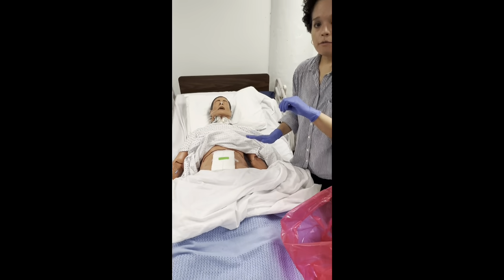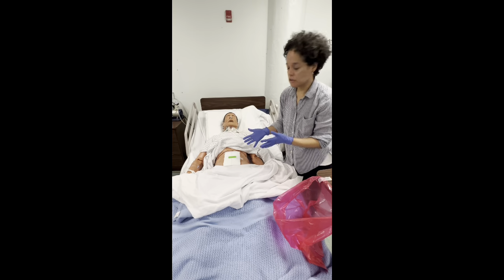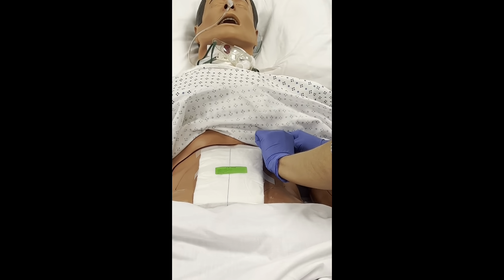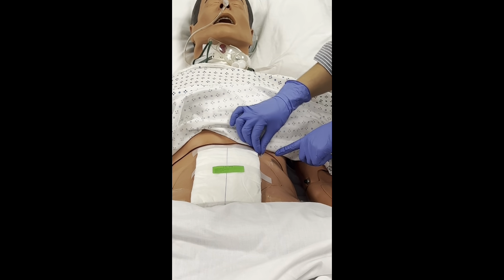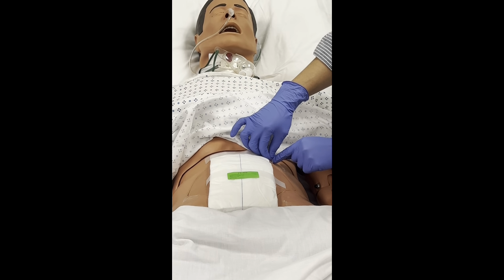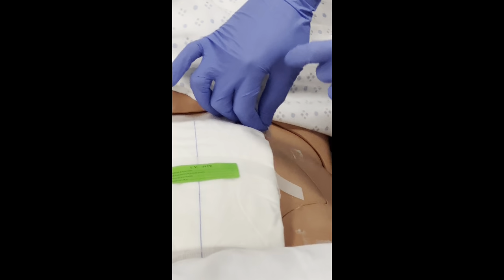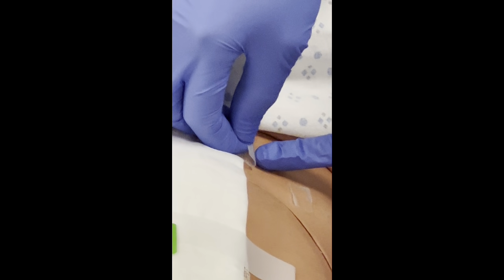You want to be mindful of your patient's skin integrity as you're doing so, please be very gentle. Okay, so let's demonstrate how this is done. Okay, so I have a piece of tape here. So have one hand pinched at the strip of the tape. So as this one is pulling away, you're going to use one finger to press down on the skin.